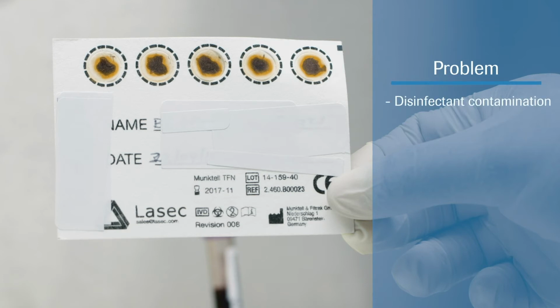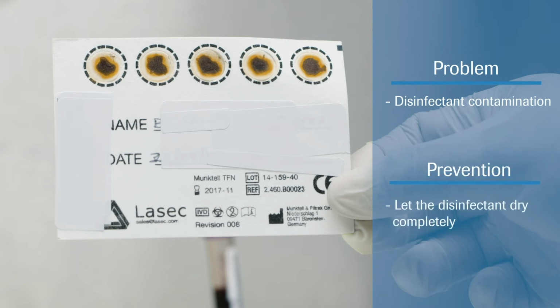This sample has yellow rings around the blood. This may have been caused by contamination of the specimen by the disinfectant. To prevent it, let the alcohol dry completely before puncturing the skin. If you are using betadine, detergent, or any cleaner other than alcohol, wipe it off completely before taking the sample.